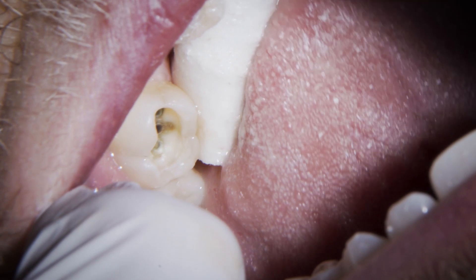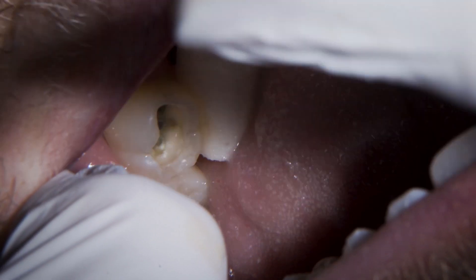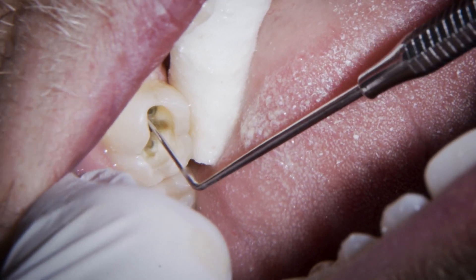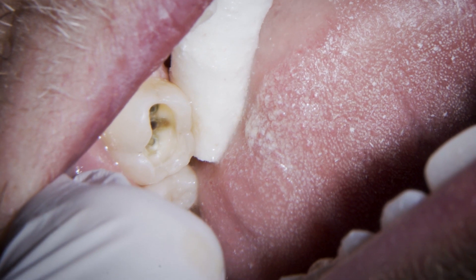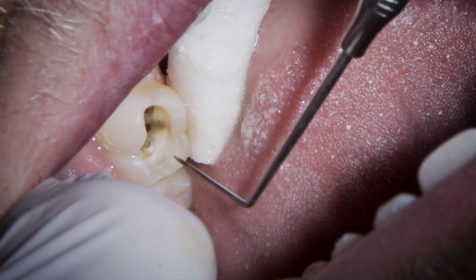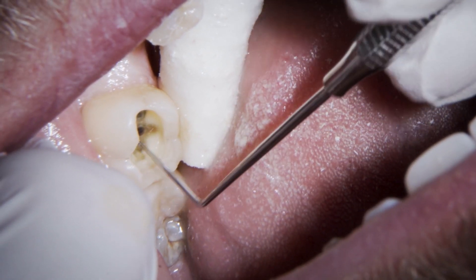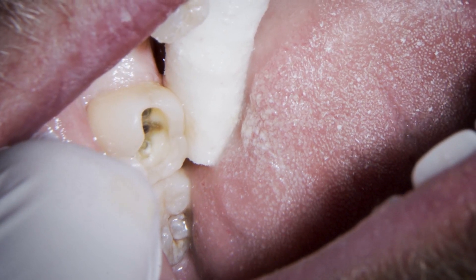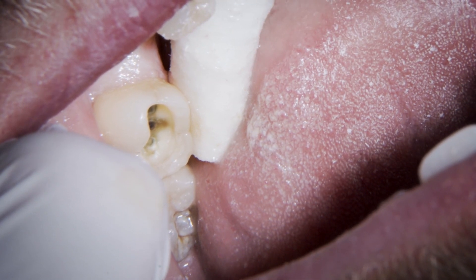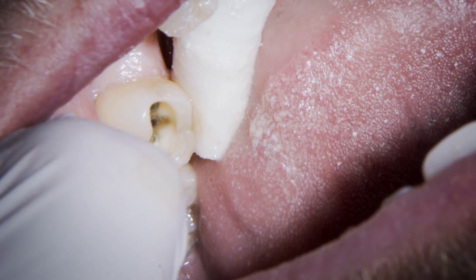Having used biodentine for many years now, you just get so much confidence with it as a material. We know that if we've got a good seal and any active caries, it's going to bring it to a standstill. When you get that bond to the surface internally, and once it's had time to really build up those links with the natural dentine, it's going to really strengthen that internal structure. And the best thing is you've got no irritation to the pulp whatsoever. That's a nice depth to get a good layer of biodentine in — as we get closer to the pulp, biodentine absolutely comes into its own, letting the pulp settle naturally with virtually no irritation after fillings are placed.